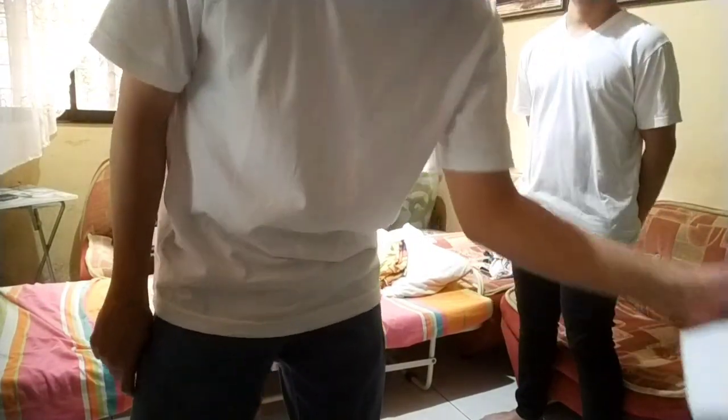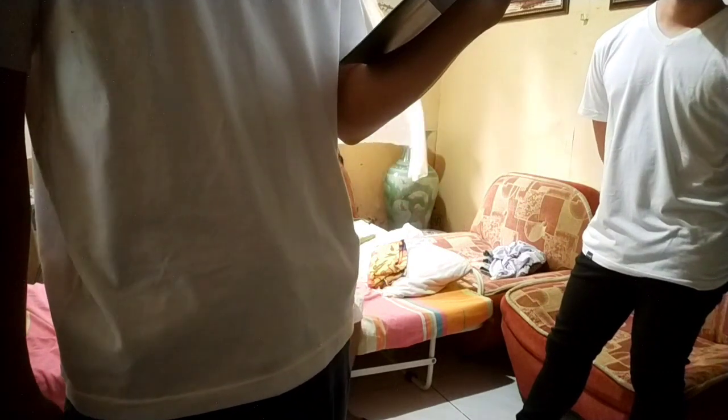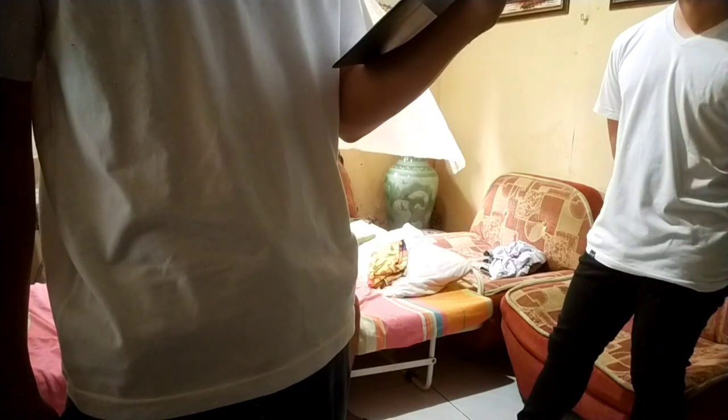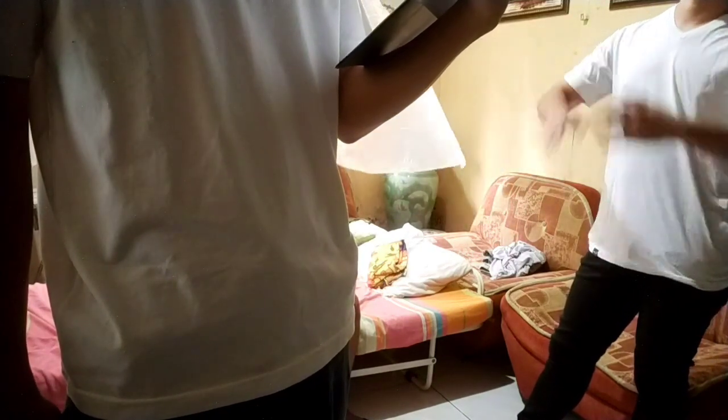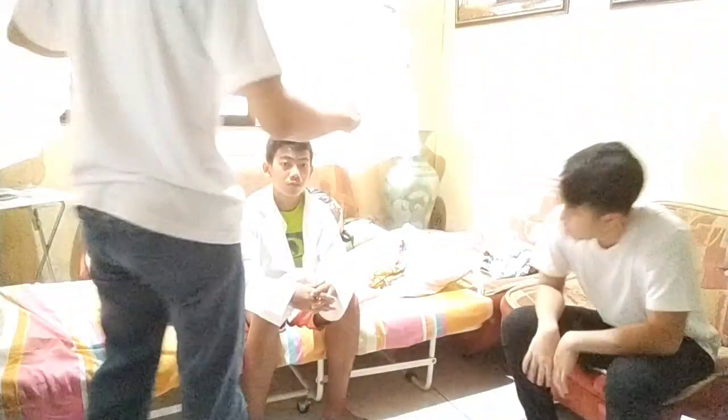So let's proceed to the variation transferring with a belt and two nurses. So even if a client is able to partially bear weight and is cooperative, it still may be safer to transfer a client with assistance of two nurses. If so, you should position yourself on both sides of the client, facing the same direction as the client. Flex your hips, knees, and ankles. Grasp the client's transfer belt with the hand closest to the client, and with the other hand support the client's elbow. So, sir, hold the transfer belt, sir.